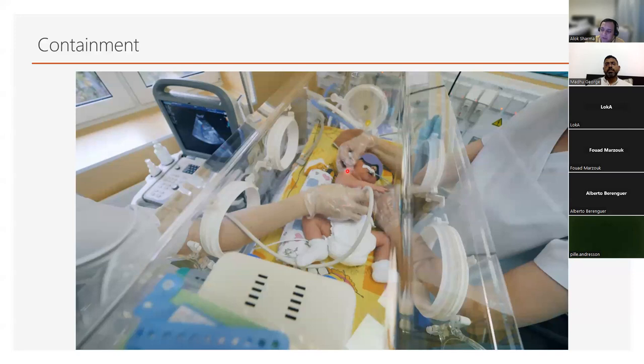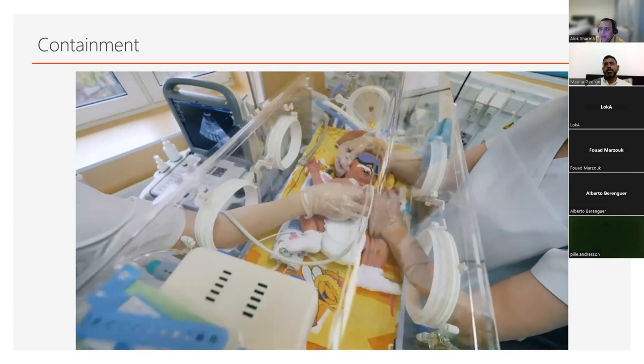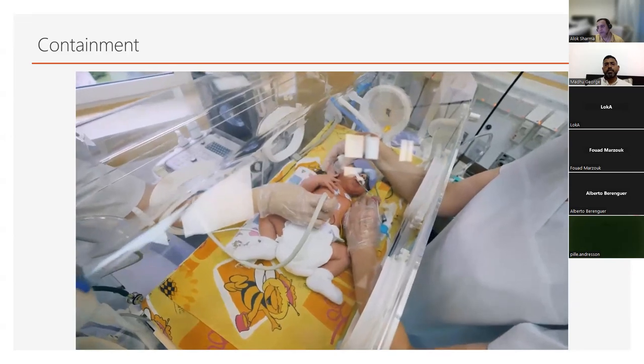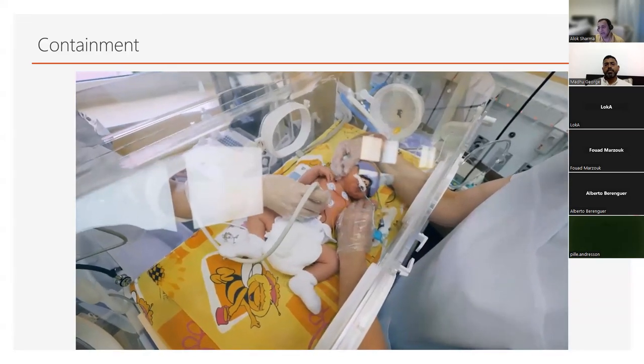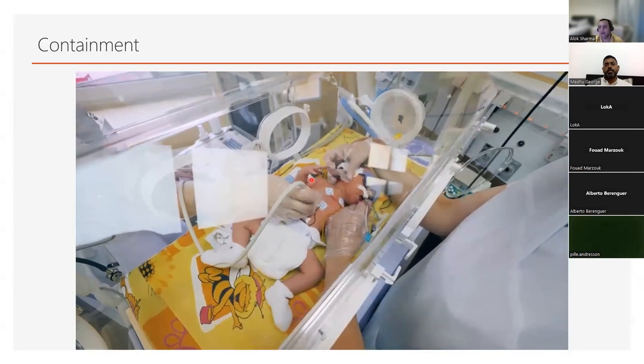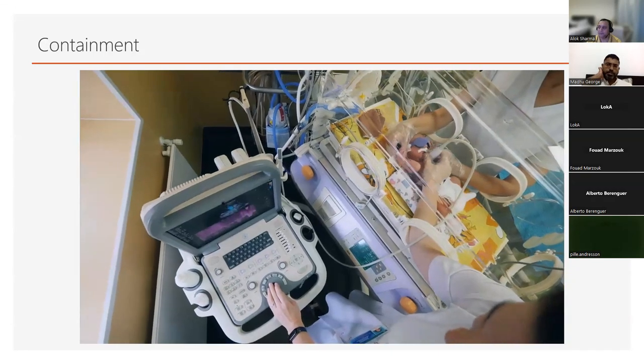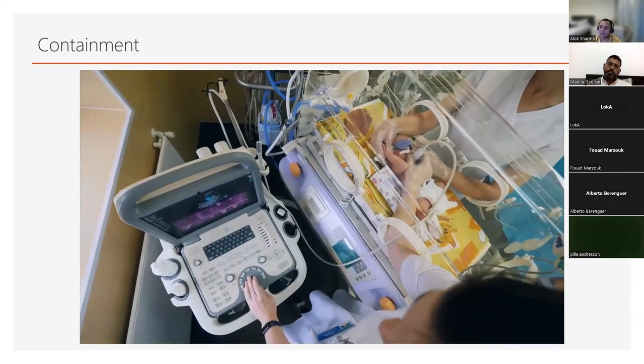So really, from my perspective, it's really important that you think about how you're scanning, levels, your comfort, the baby's comfort. But can you see how this baby, movement, all of these things, it's not going to make your scans easy. But holding that hand, that right upper hand, just in this particular situation, keeping the baby distracted using sucrose can keep your baby still, and can actually improve your image quality. Again, just another example. Can you see how holding the hand benefits?